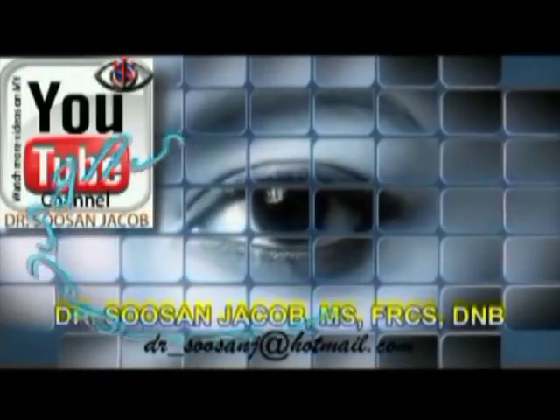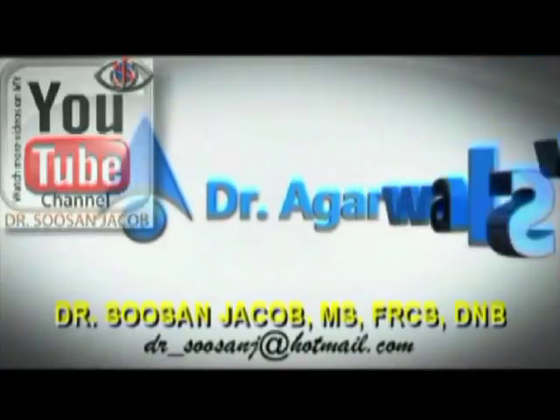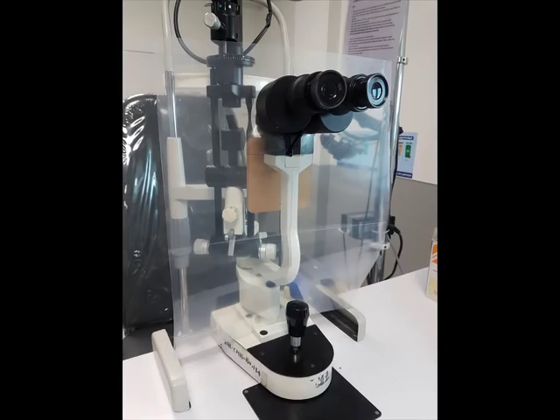Hi everyone, I'm Susan Jacob and in this video I'm going to show you how we made a slit lamp protector shield in view of the increasing coronavirus infection around the world. This is important because we as ophthalmologists are exposed straight to the breath of the patient up close, and very often a sneeze reflex may also be elicited when you throw the light into a photophobic patient's eye.